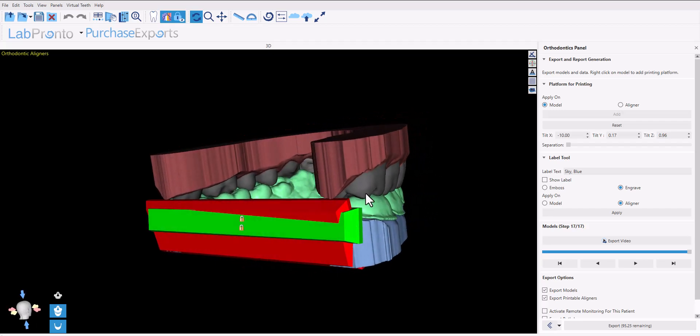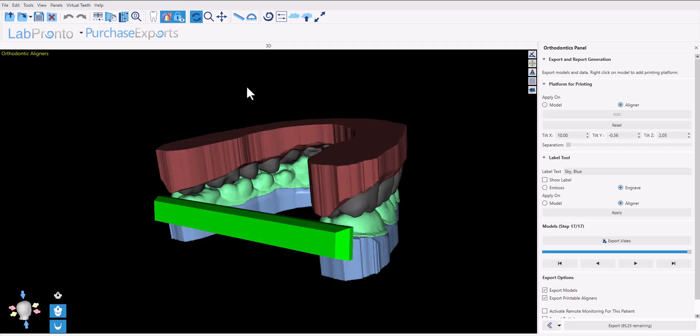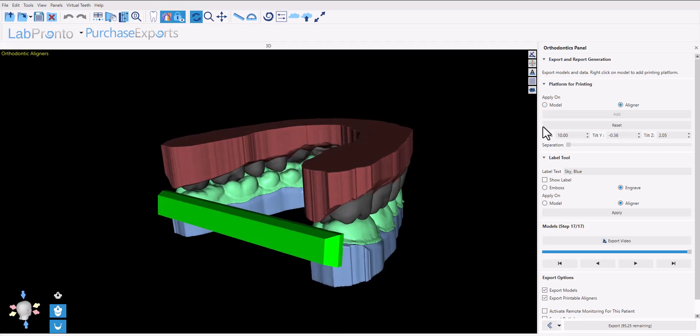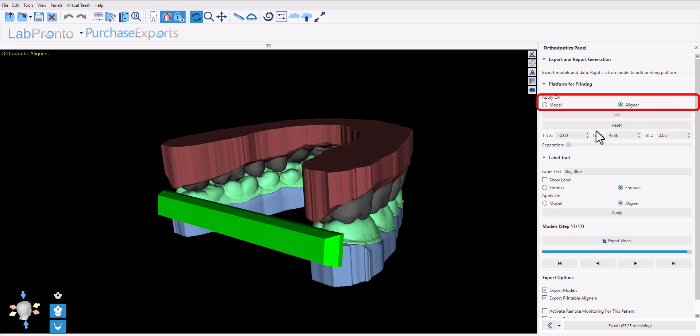You also have the usual options to add platforms both to the model and to the aligners for vertical printing. When making changes to the platform for vertical printing, make sure to select the proper radio button to make the changes to the model or to the aligner.